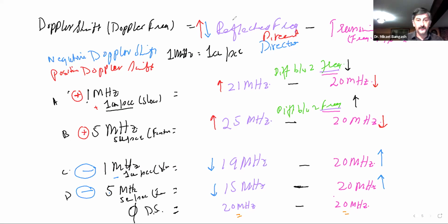Now, two scenarios where you may get a 0 Doppler shift. One is if you have said bye-bye to the patient. He or she is long gone. At least there's no flow of blood. Clear? Then you should start getting worried. But would we be able to get a 0 Doppler shift on an alive patient where the heart is still pumping blood? Yes.